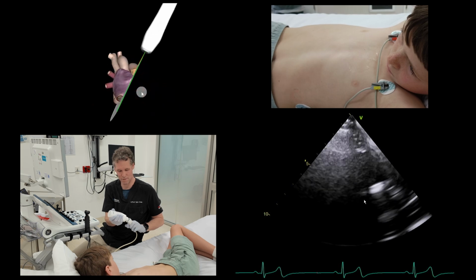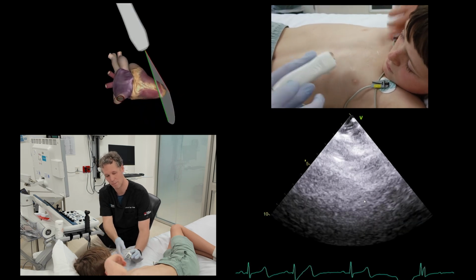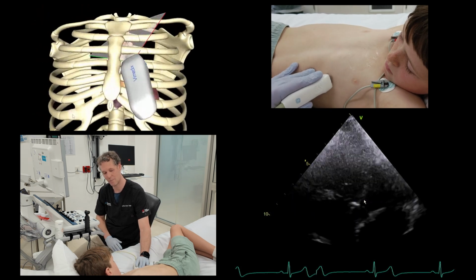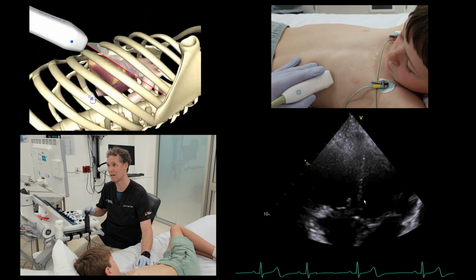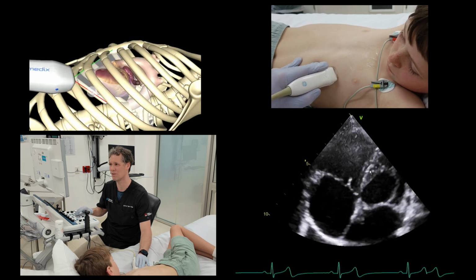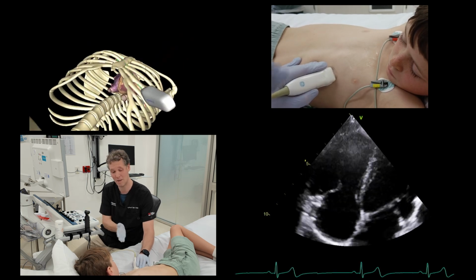Okay, next view we're going to go for is the apical view. Apex, holding that probe like a pen, have that marker pointing down towards the bed, feel for the apex beat, and I point up towards the patient's right shoulder. And I'll just try and find something that's moving around. And here underneath this, I can almost see this is the right ventricle here, this is the left ventricle, left atrium, right atrium. So that tells me that I'm sitting too medial.